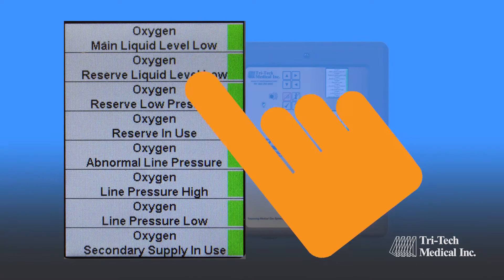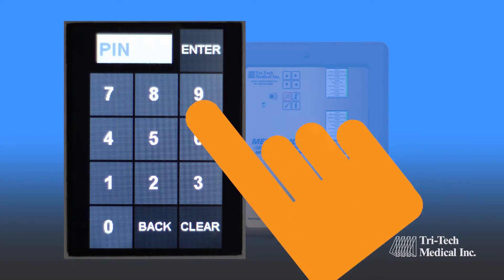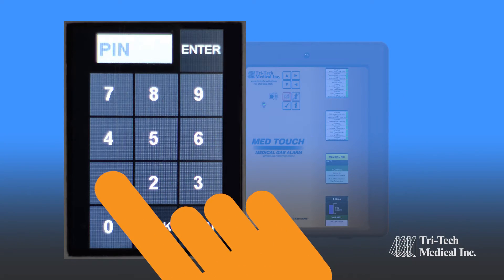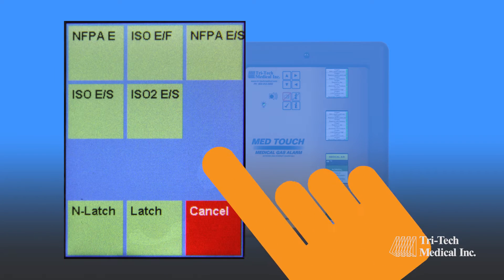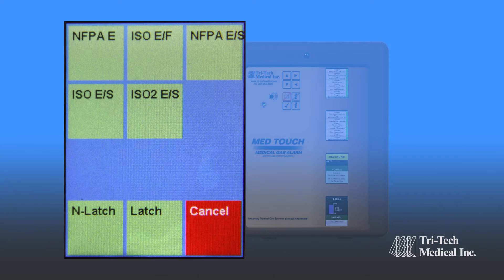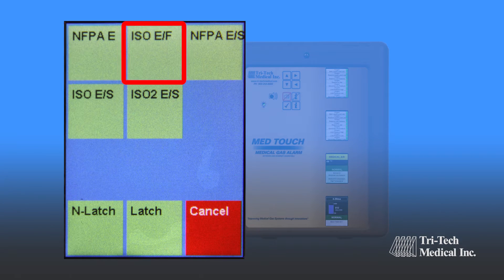MedTouch Master Alarm labels are selectable from the preloaded data file in NFPA and ISO formats in English, English-French, or Spanish languages.